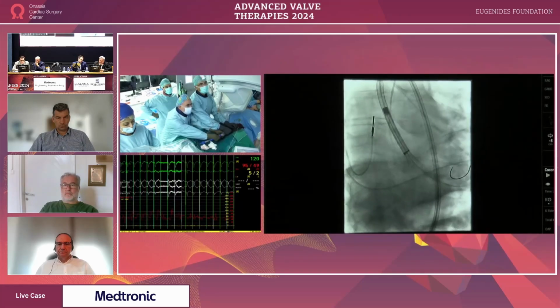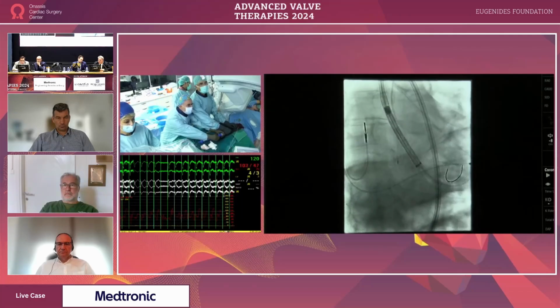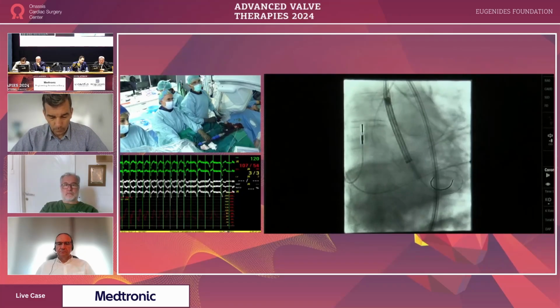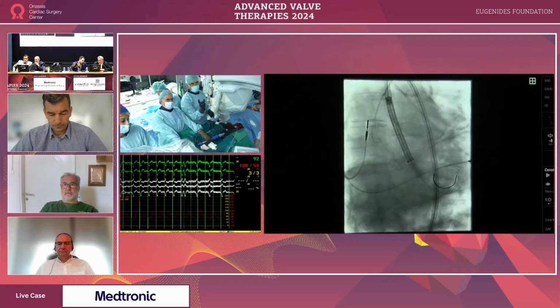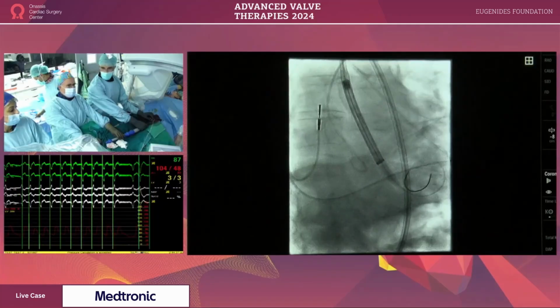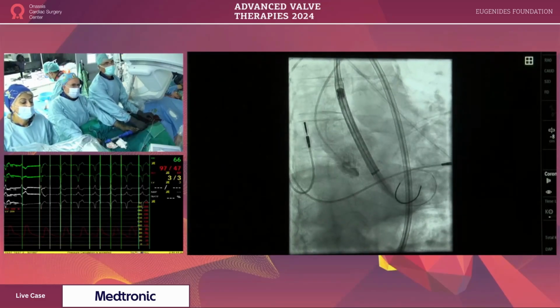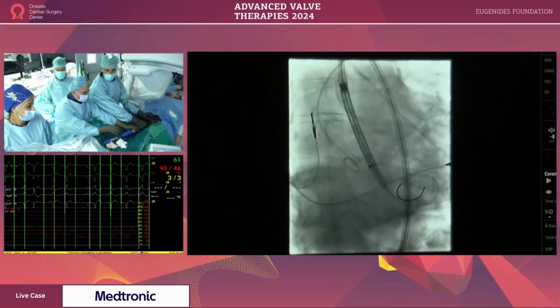Maybe, as you show us, one of the other things is the commissural alignment technique, the capsule. Okay, start. Okay. Capsule head marker. Maybe you can control it on the cusp overlap view and then release the valve. You need to magnify more. Go a little bit now, we're a little bit high. Try to inject a little bit. So we're very low now. The pigtail at least is in proper position. So I'm going up a little bit. And then we can start from here, I suppose.